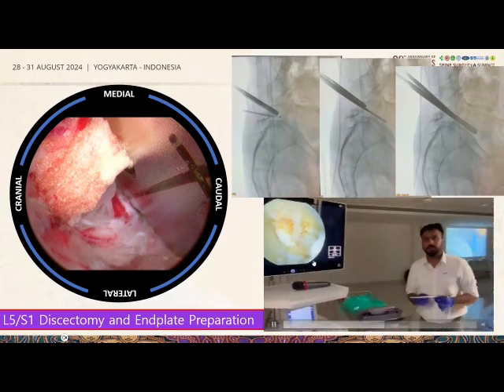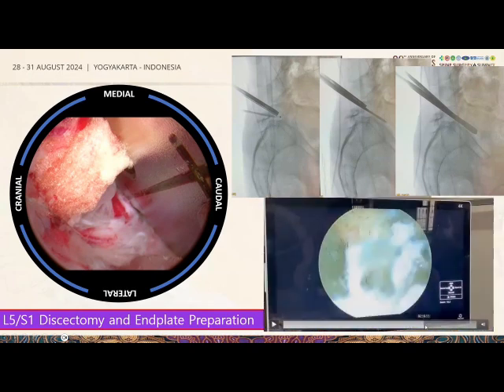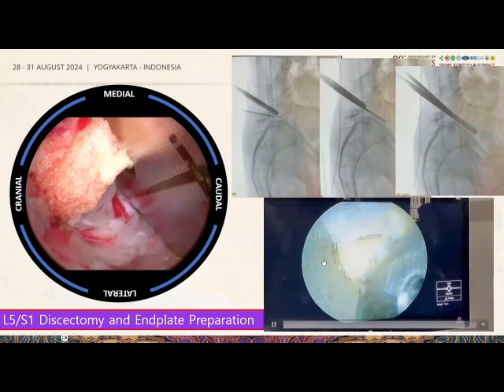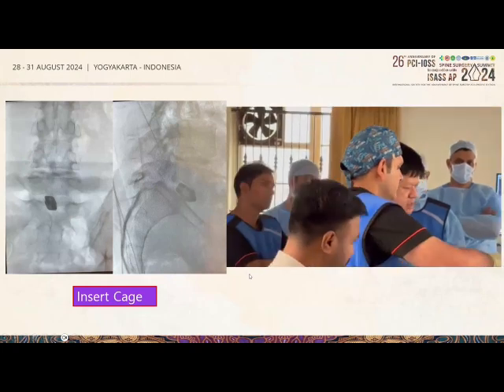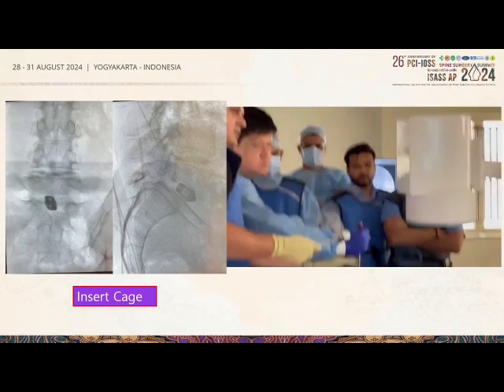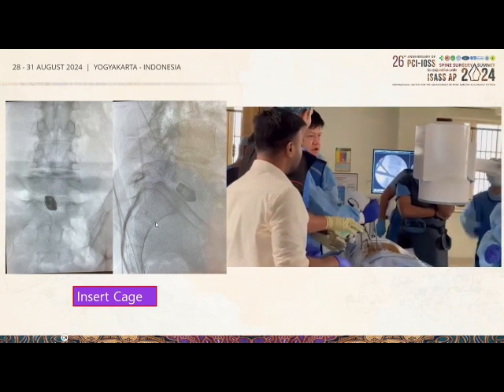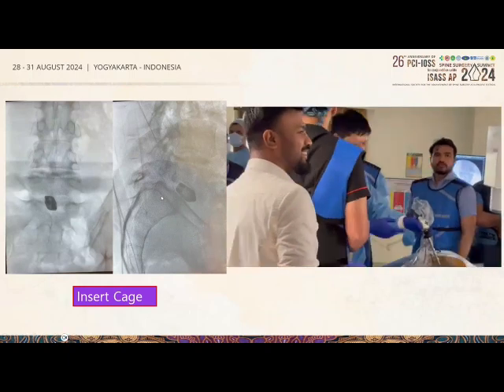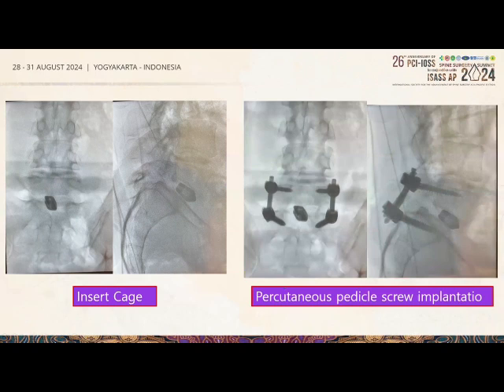As seen in this Brunei demonstration, we use a metal retractor to retract the exiting nerve roots, find the correct trajectory, and prepare the disc. It is all under direct endoscopic vision — you can see the edge of the signal clearly. We then insert the cage glider. In Brunei we were using an X-DELIF cage so we had to gradually horizontalize it, but in my actual Singapore case a couple of months ago we inserted the cage directly using a TLIF cage as in open surgery. Then we proceed to percutaneous screw insertion.